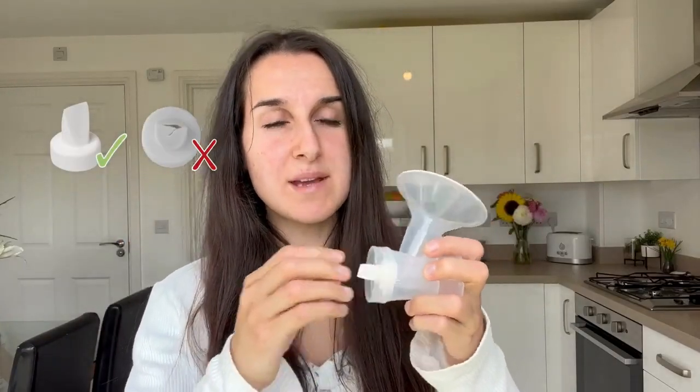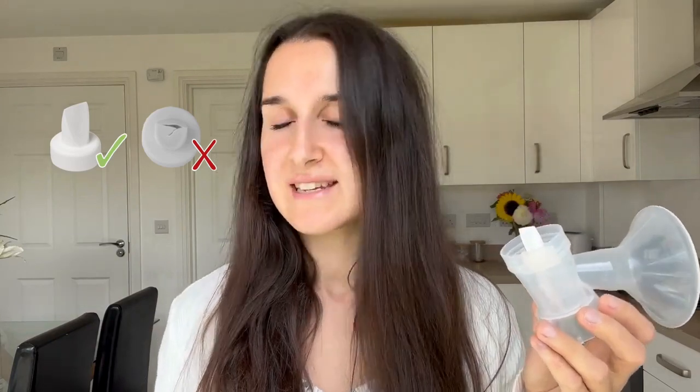This is the lip valve which is connected to the breast shell here — be careful when using this as it's a really important part of the pump. Check to make sure it's intact with no tears; if there's any damage you will need a new lip valve. Take it off from the thick sides and avoid pulling the thinner wedge part, and don't use a bottle brush to clean it.